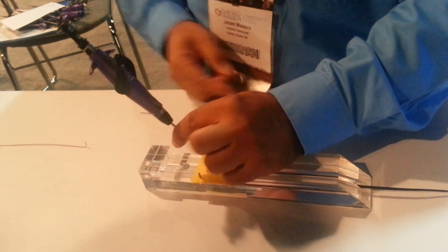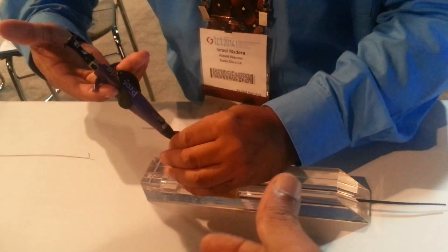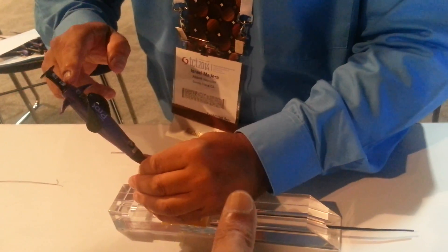So once I have that, still holding with this hand right here, still maintaining pressure right here, I'm going to go ahead syringe-like. I want to hear and see — all the way. Hear and see. You did not get a good one. That was good — you didn't get a good one.